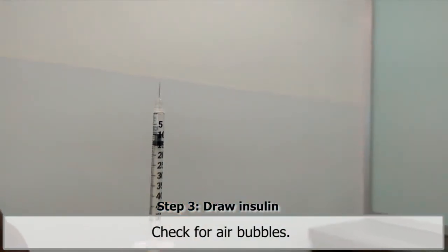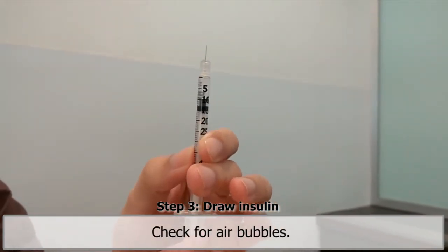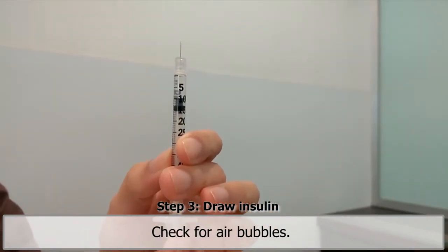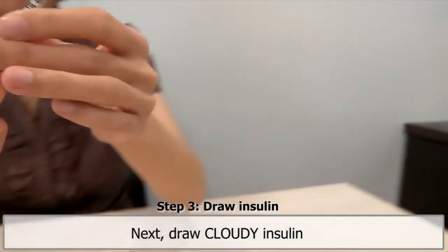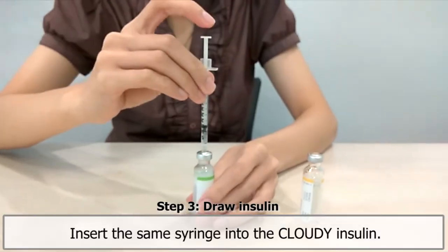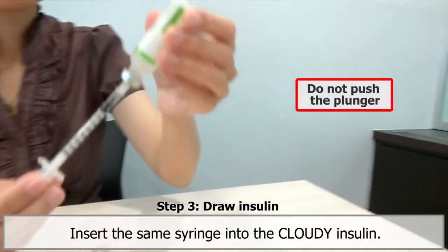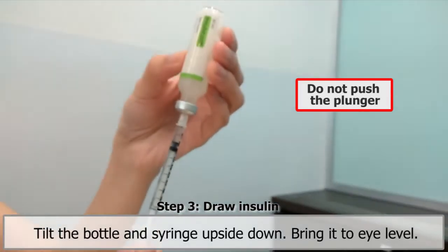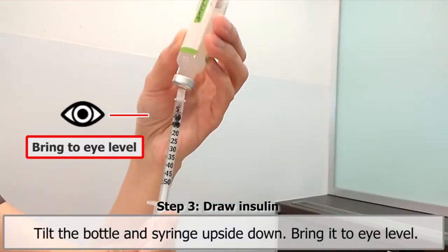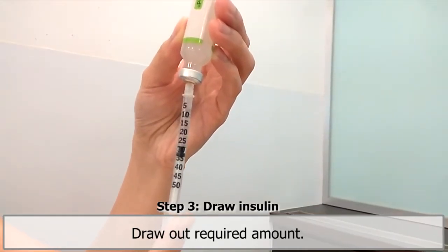Check for air bubbles. If present, gently tap the syringe to move bubbles to the top, then push the plunger gently to expel bubbles. Next, draw cloudy insulin. Insert the partially filled syringe into the bottle of cloudy insulin. Do not push the plunger. Tilt the bottle and syringe upside down and bring it to your eye level. Draw out the required amount of cloudy insulin to make up the total dose and remove the syringe.